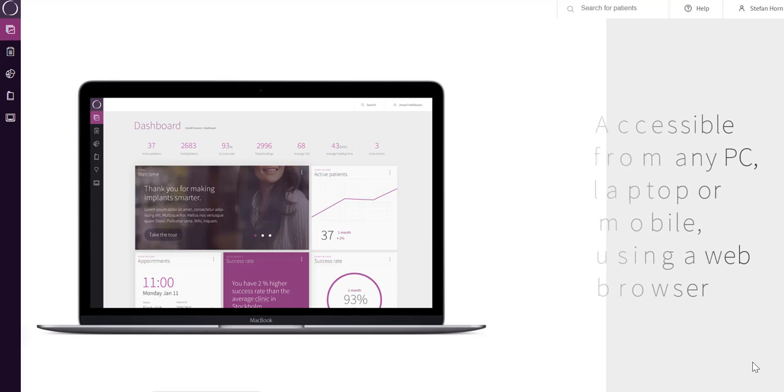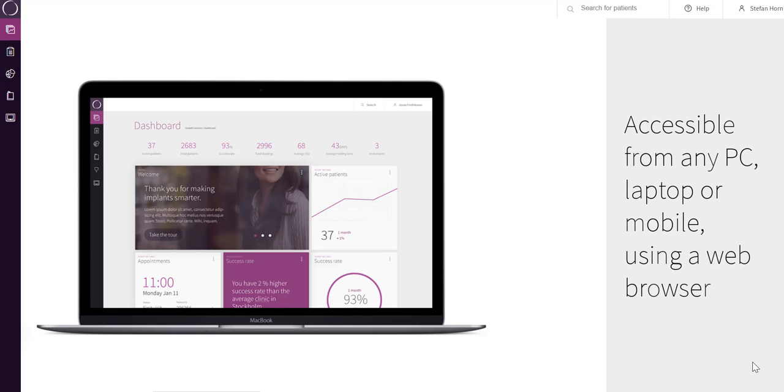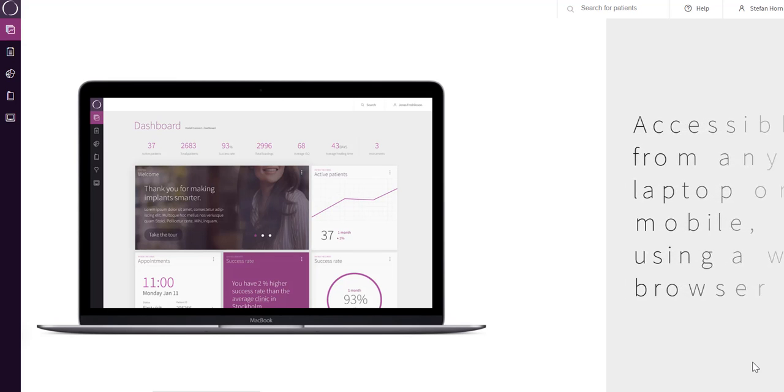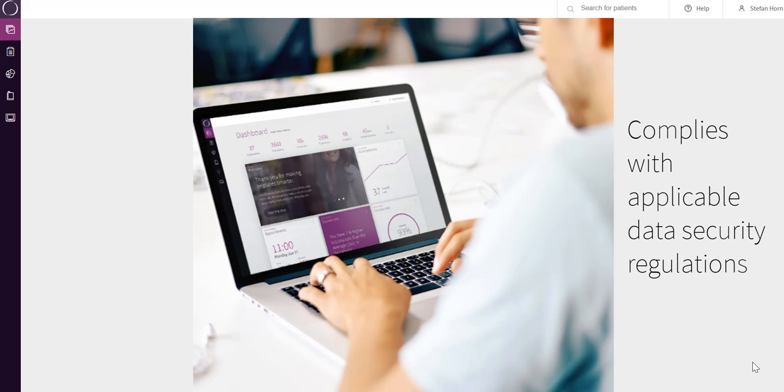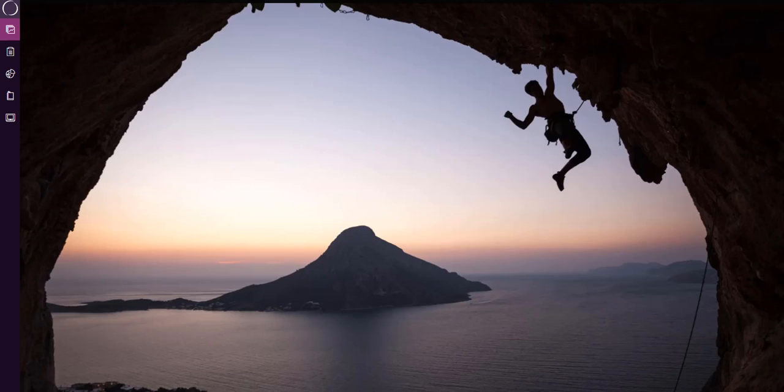The web portal is accessible from any PC, laptop, or mobile device using a web browser. Austell Connect complies with applicable data security regulations like HIPAA.